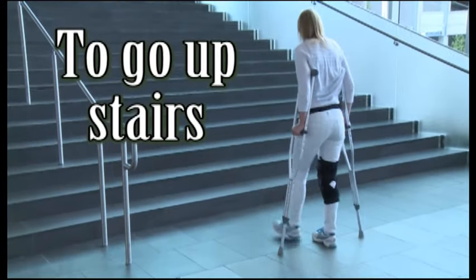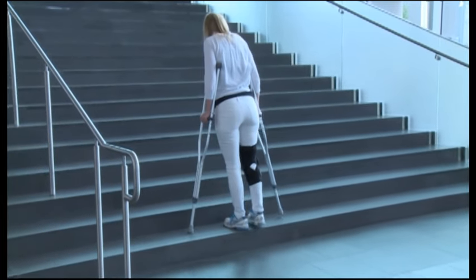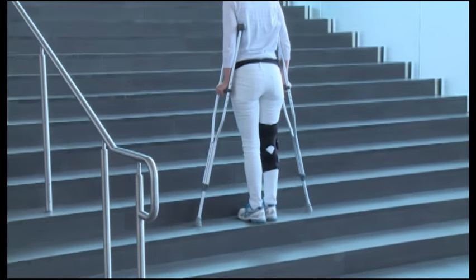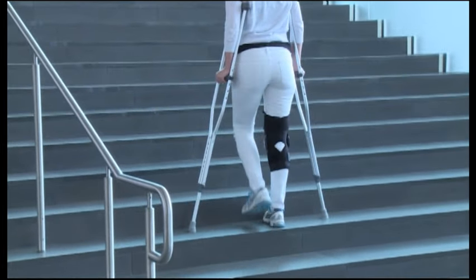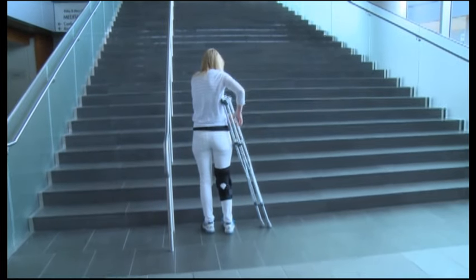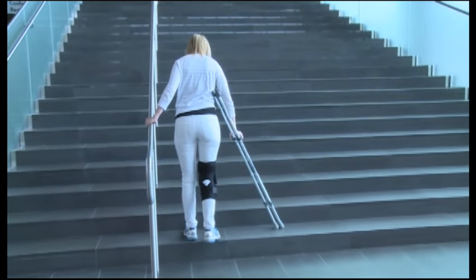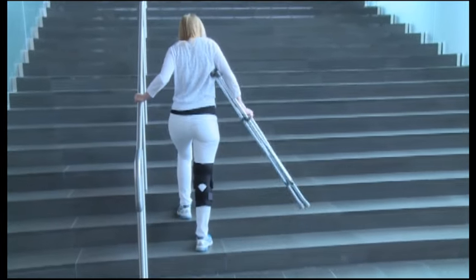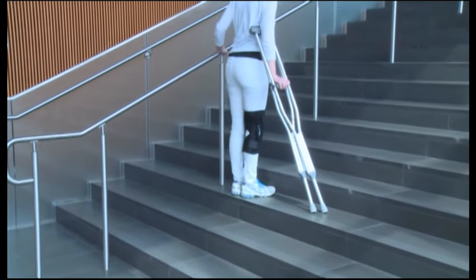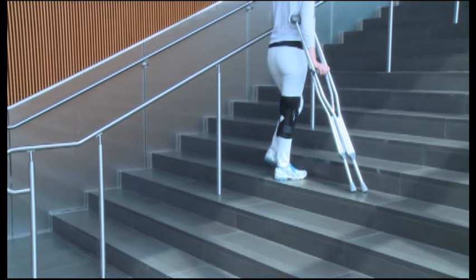To go upstairs, begin close to the bottom step. Step up with your healthy leg first, then lift up the crutches, then the injured leg. Check your balance before you continue. If there is a sturdy handrail available, you can place both crutches under one arm and use the handrail with the other. Remember, step up with the good foot first and then the crutches, and lastly the injured foot or leg follows.